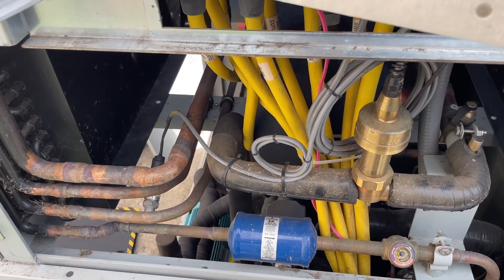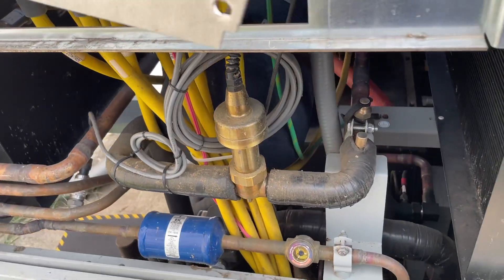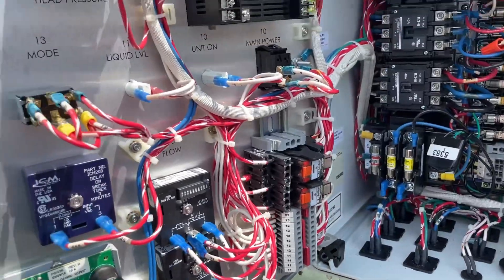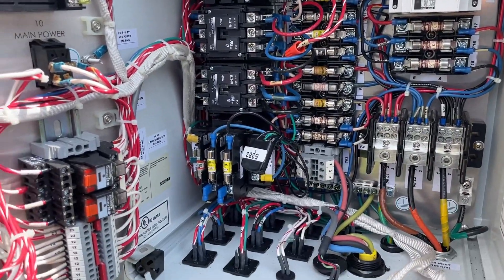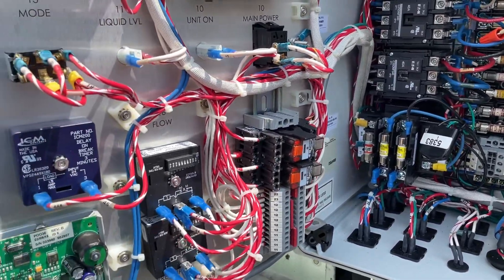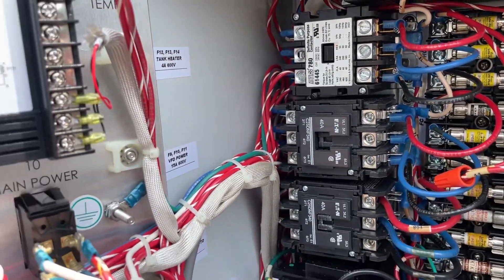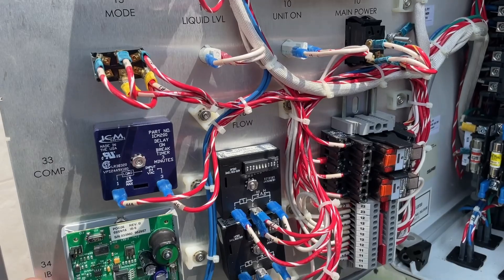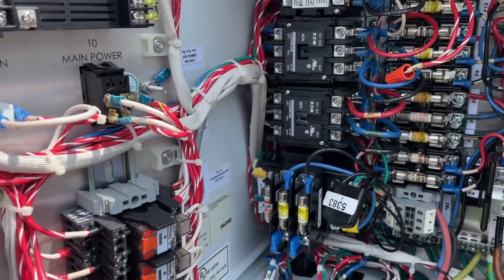Here's a look under the skirt here — she's very, very fancy. It's like an EV or something. There's the main control cabinet. To be honest, it smells like burnt electronics, so I need to get in here and see if something let out the magic smoke.